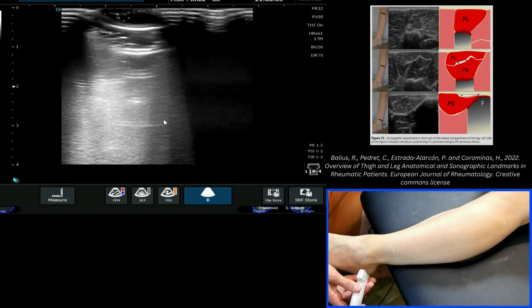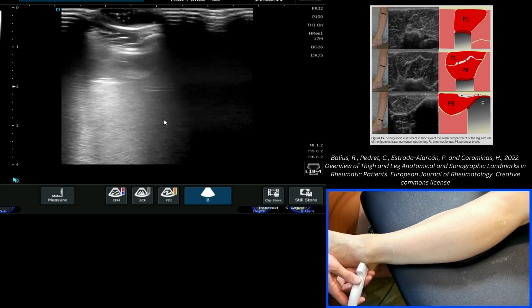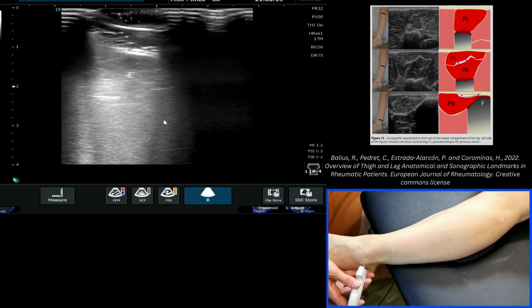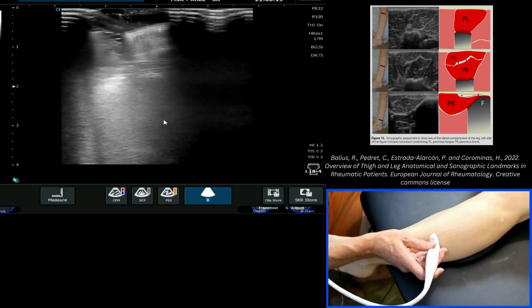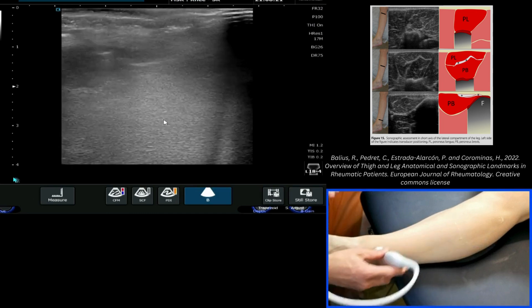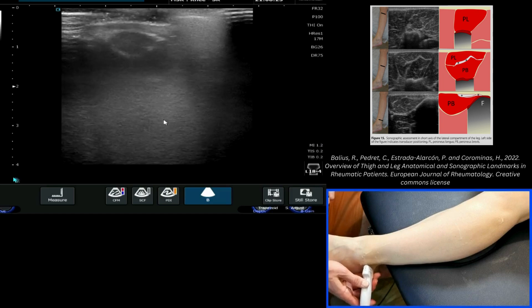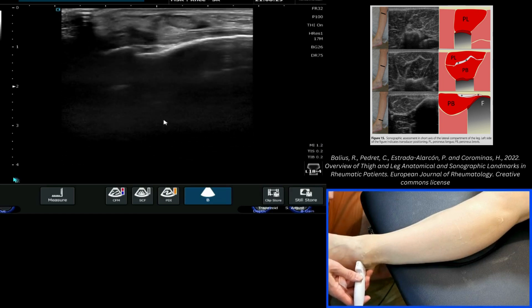This video explores the visualization of the peroneus brevis and longus muscle in the lateral compartment of the lower leg. The easiest way to find this is not necessarily to place your probe directly onto the shin — it's actually to place your probe slightly more distal, around that retromalleolar region, where you've got the peroneus brevis and longus.